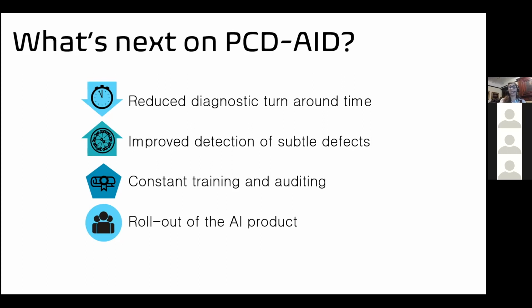And this is a good tool, because the expert goes to those images and to those results and can focus on the ones that the machine flagged, saying, well, maybe you should pay more attention to this patient because I thought it had like 27% of abnormalities. Okay, maybe good to look through these images and see how it looks. So this is how it would be. Again, I basically already spoke a little bit of improved detection of subtle defects because of its very objectivity of analysis.